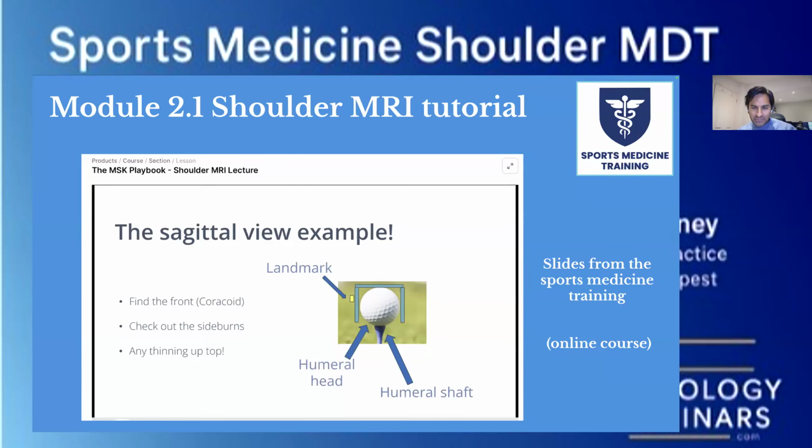What is the specificity of MRI in detecting fractures, including occult ones? So very good actually, because remember I was telling you about fluid being bright and everything else being dark. If you've got a fracture, by definition, you're probably going to have some edema, and so sometimes very subtle fractures can come up really, really bright. MRIs can be very good for looking for stress fractures, which can be very small, hard to see on an X-ray.